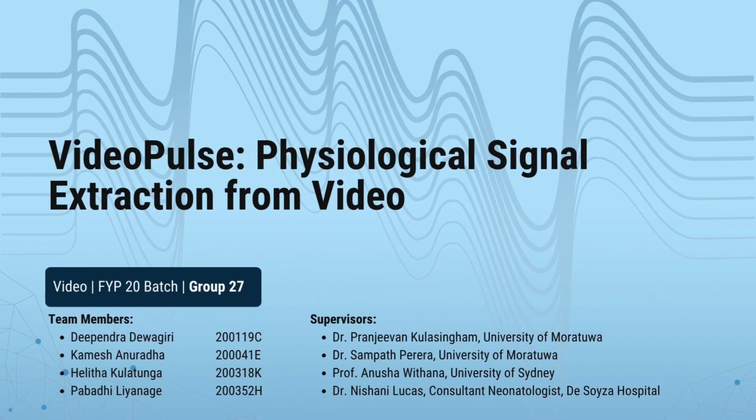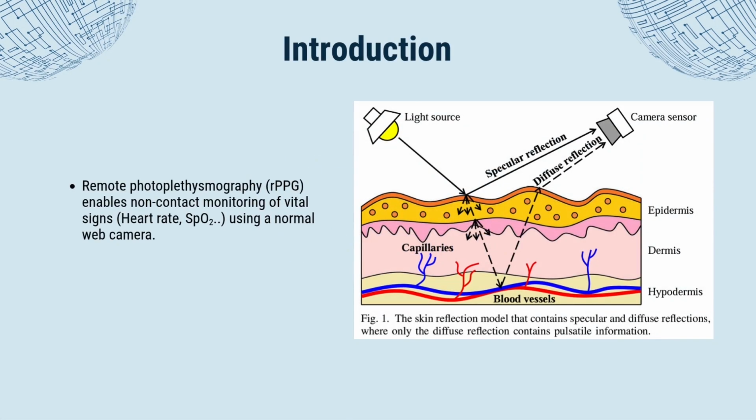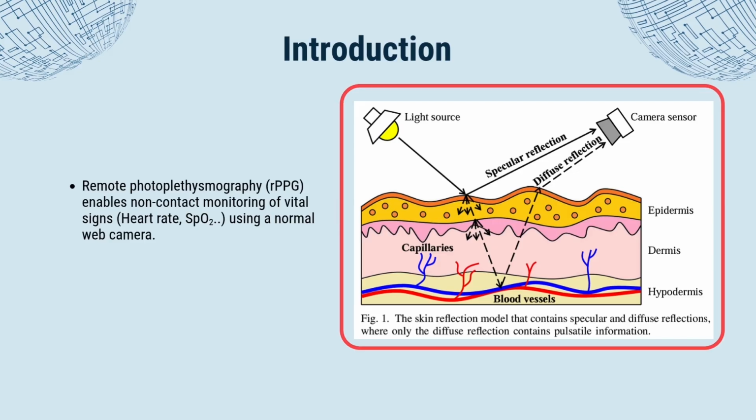VideoPulse, physiological signal extraction from video. Introduction. Remote photoplethysmography enables non-contact monitoring of vital signs like heart rate and SpO2 using a normal web camera. Let's look at the diagram.